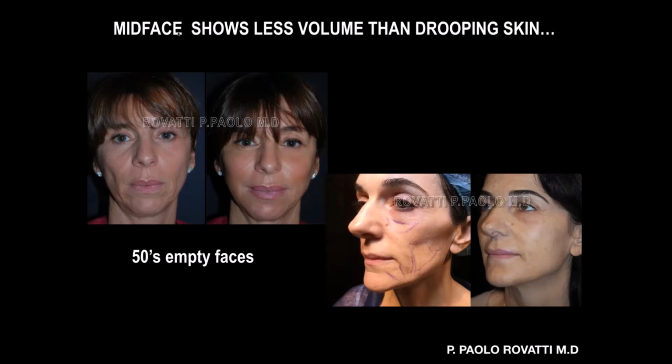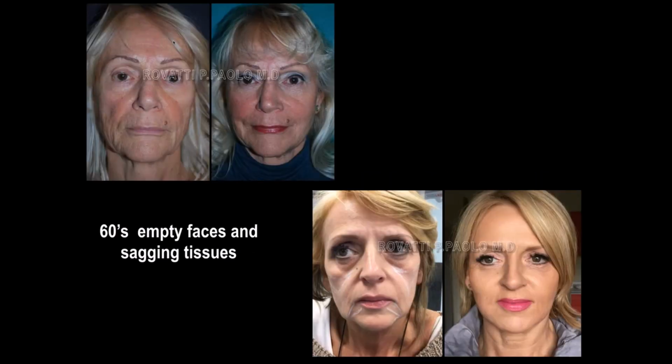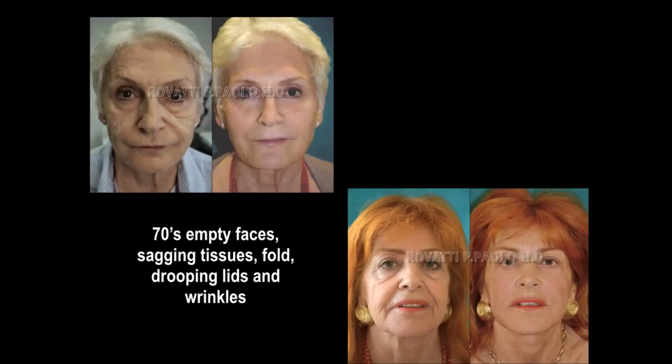In the 50s, there are empty faces. You can see on the left it is very empty in the malar area, and everywhere we can feel it. So the mid face is good for filling. But even in the 60s, there are empty faces, and they also have sagging tissue, but really we put some volume in and we get good results even without lifting these areas. In the 70s, the empty faces have sagging tissues, folds, drooping lids, and wrinkles, so they are starting to have many problems. The upper third shows aging too.